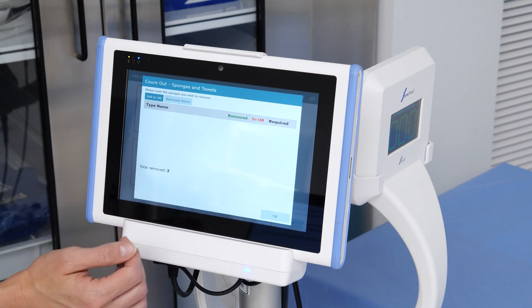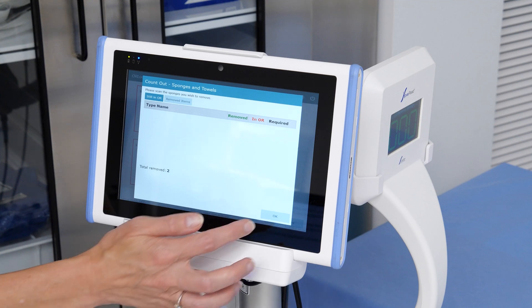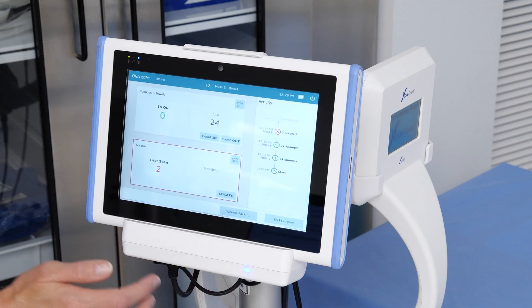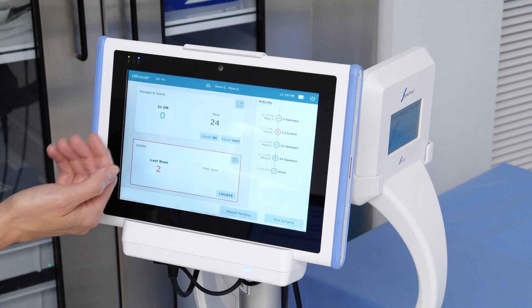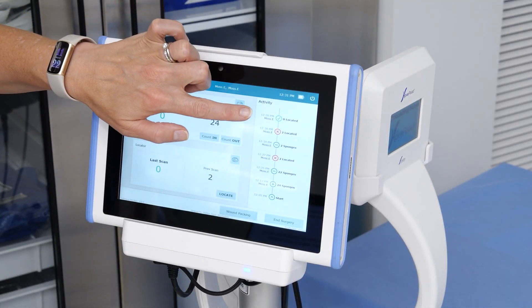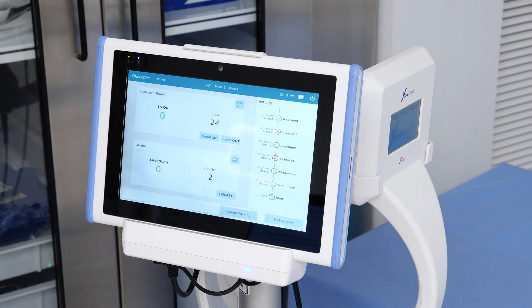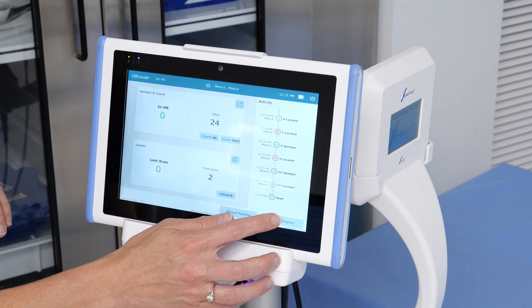Notice that all sponges have been removed from this surgical case. Finish the count-out by pressing OK in the window's lower right corner. The sponge counts have now been reconciled and all case activity is listed in the activity window. With the sponge count-out complete, press END SURGERY to close out this case.